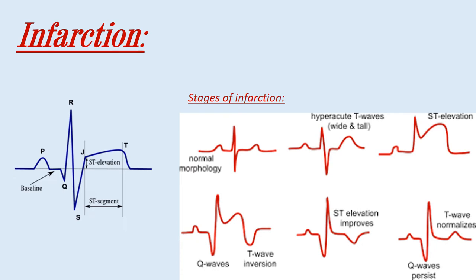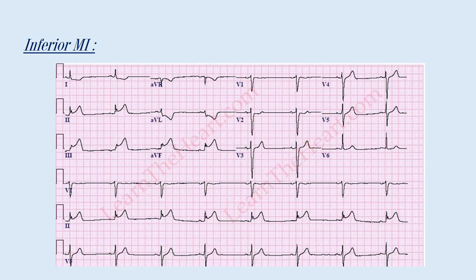One of the most common cases is myocardial infarction, which is characterized by ST elevation. However, there are stages of infarction: starting with hyperacute T wave, then ST elevation which is the most famous, then Q wave and T wave inversion, after that ST elevation improves, and finally you can just see the Q wave with everything else normal. This is an ECG of an inferior MI — we can see the ST elevation in leads 2, 3, and aVF.